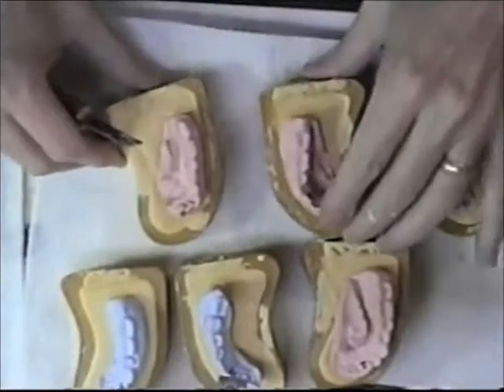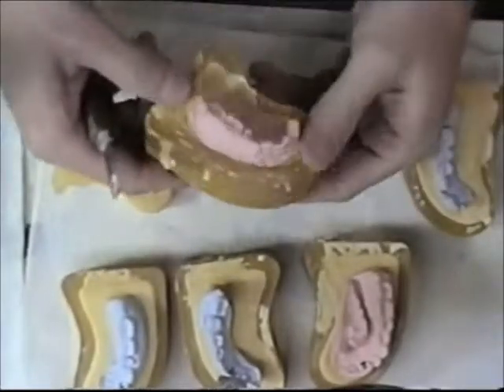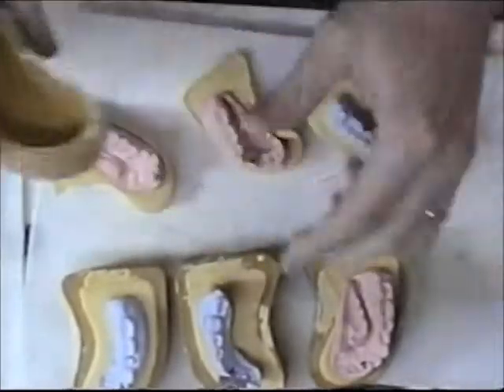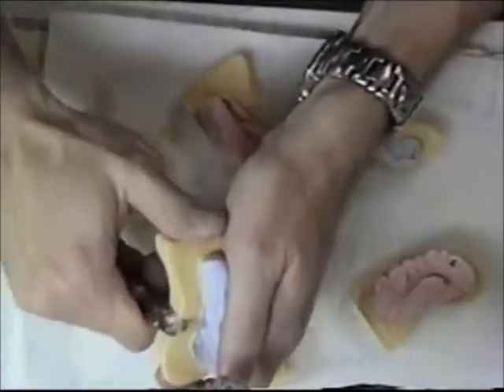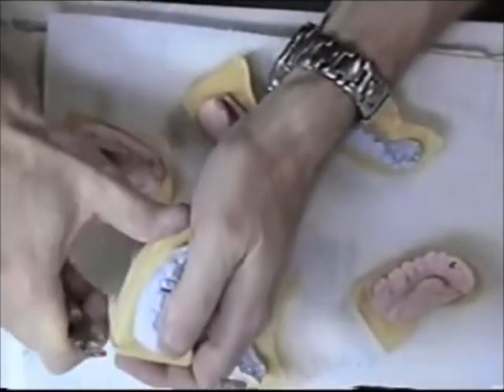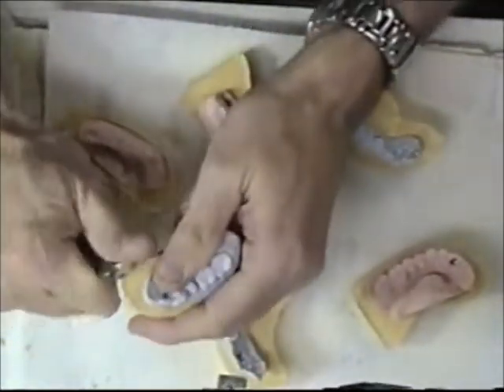Now that the lab stone is hardened, I can pull it out of my molds. Any sharp places, I can just use my lab knife to trim that off and smooth it up nicely.